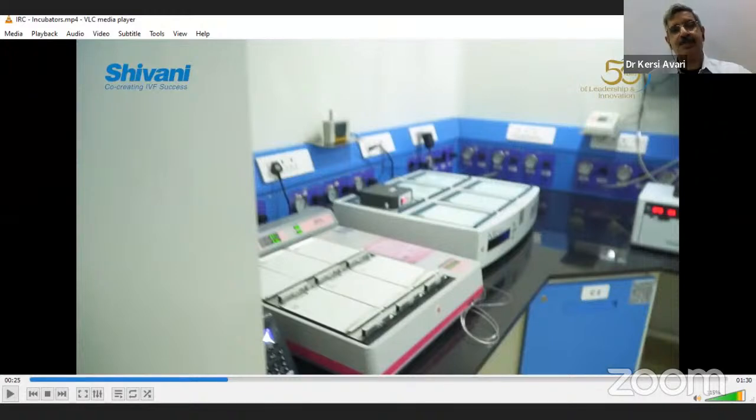The embryo suspended in this environment, plus the media, has a scenario quite similar to the uterine environment with the lovely protein-rich uterine secretions and a very lovely capillary bed, proliferated endometrium on which the embryo will come, implant, and the process will go on further.